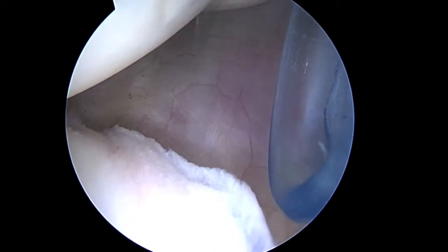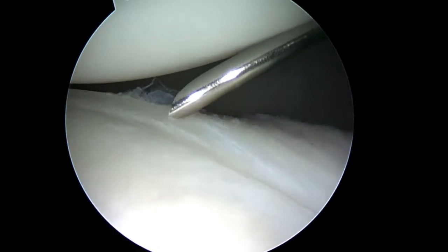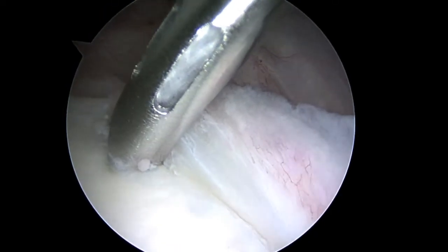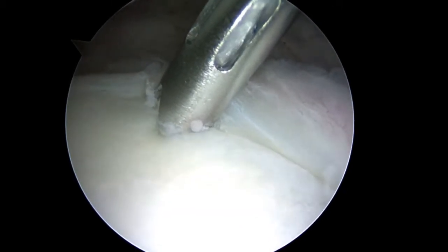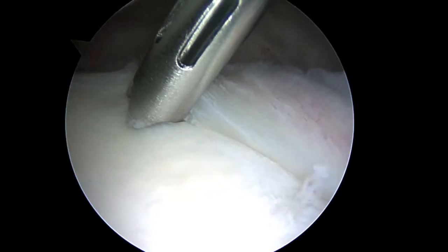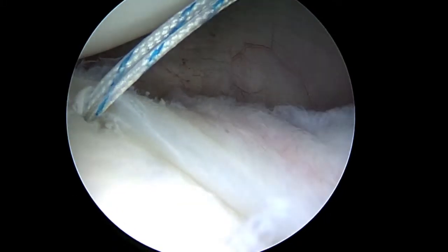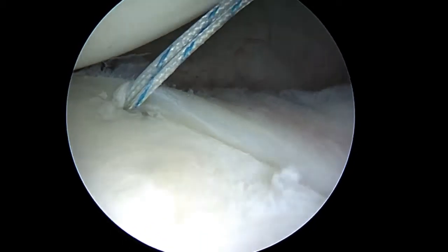So now we'll take a spinal needle and we're going to try and find a good angle to place the suture anchor down. That looks like a pretty good angle right there — you get the anchor down into the bone. We'll work on that in just a minute. So what we're showing you now, we're just tapping the anchor down into the bone. Next we'll unload the inserter and make sure we have good fixation. That looks like it's pretty solidly in the bone — pulling pretty hard on it.